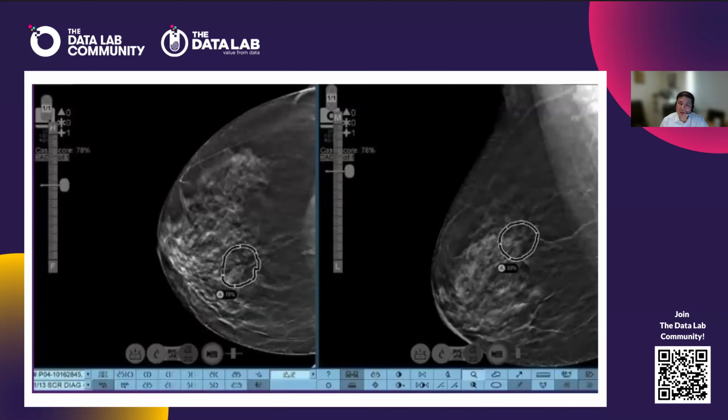Most of the mammograms you hear about are 2D mammograms, which is the 4 views that you take when you come for breast screening. But in the US and elsewhere in the world, and also in the symptomatic one-stop breast clinics, we're seeing more 3D mammograms, where it's like a mini CT scan taken by the mammogram machine across an arc, and you have up to 100 to 200 little slices of mammogram images.